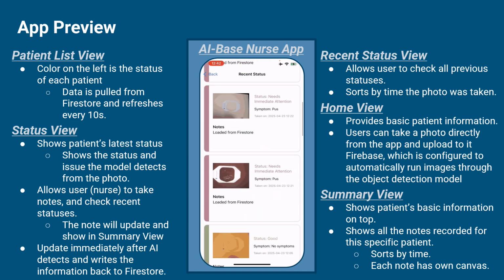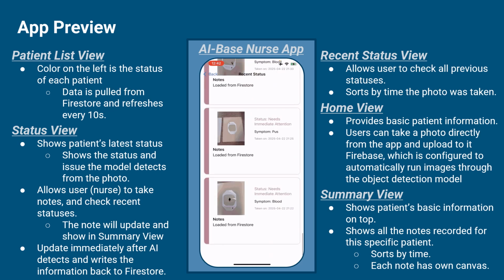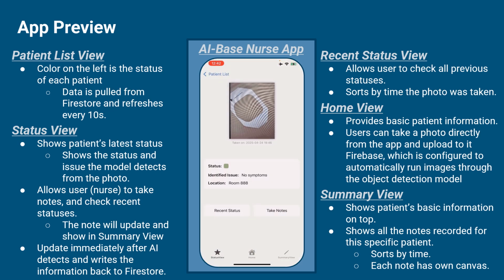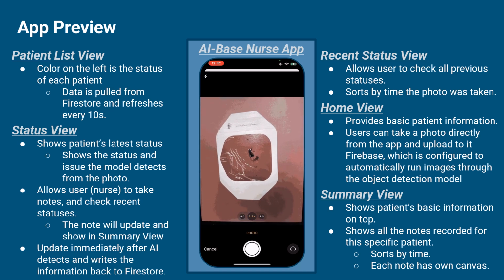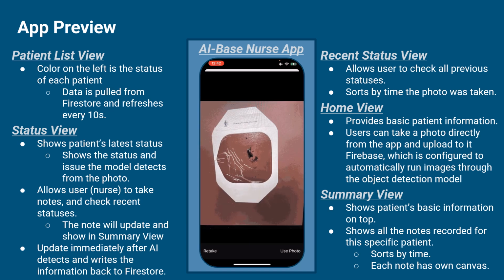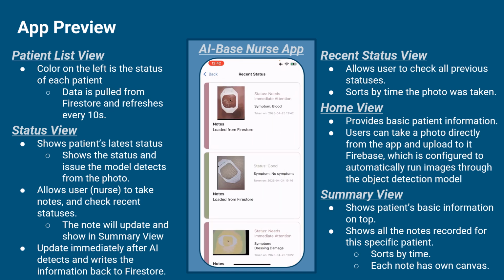By using object detection to automate the task of monitoring patient dressing sites and creating a mobile phone application that shares data from a patient to a nurse, we've streamlined the monitoring and execution process of dealing with early signs of infection in hospital patients. With this prototype, we hope to significantly cut down the time used to check on each individual patient for these issues, while also decreasing the risk of human error when overlooking signs of infections among the dressing sites.